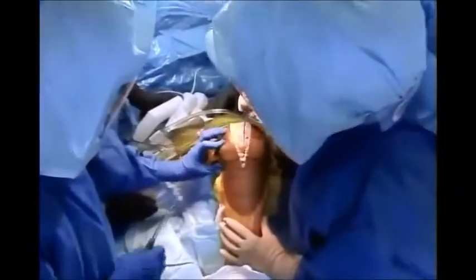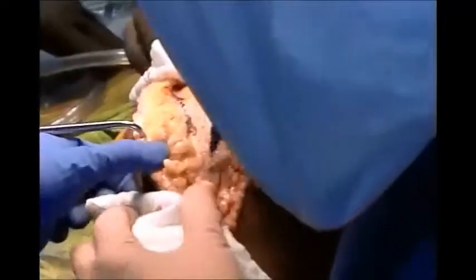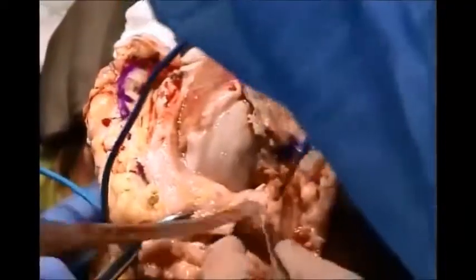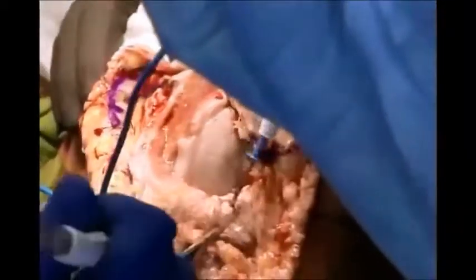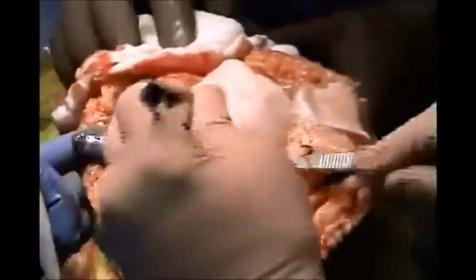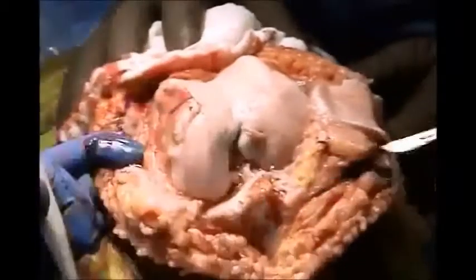This is done without tourniquet. The patient's knee is flexed to 100 degrees under hypotensive anesthesia. A long median parapatellar incision is made from the tibial tubercle to two fingers above the patella.